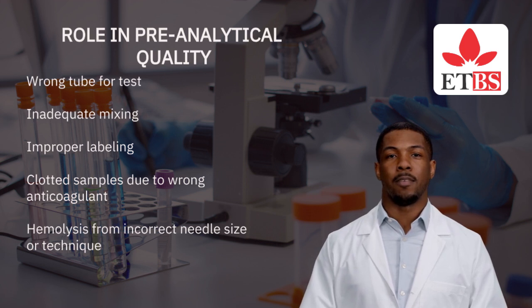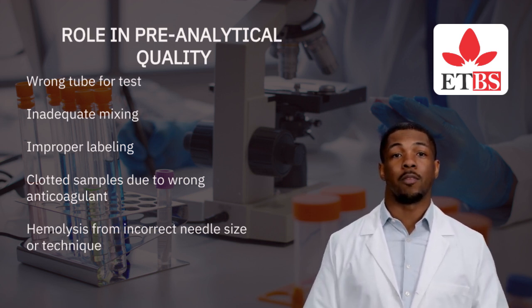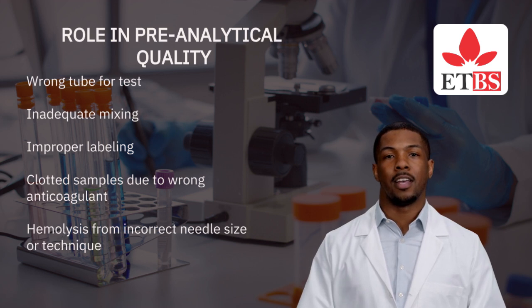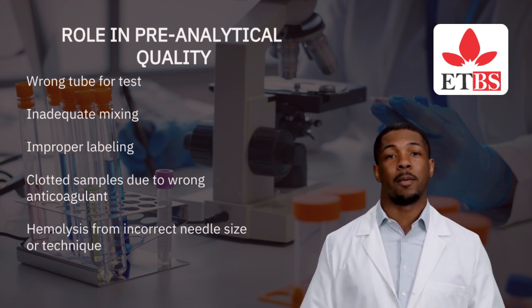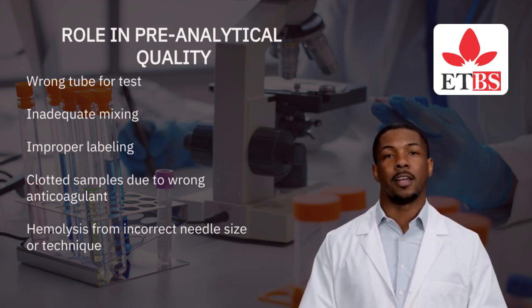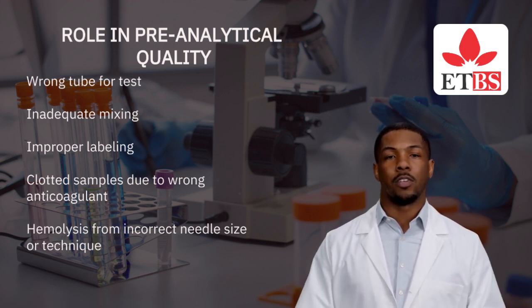4.6 Role in pre-analytical quality. Up to 70% of laboratory errors occur in the pre-analytical phase, many of which are related to improper equipment use, such as wrong tube for test, inadequate mixing, improper labeling, clotted samples due to wrong anticoagulant, and hemolysis from incorrect needle size or technique. Phlebotomists are frontline guardians of laboratory accuracy.